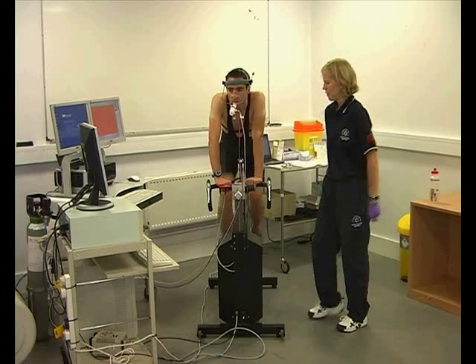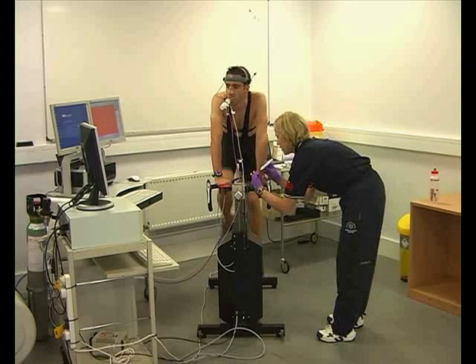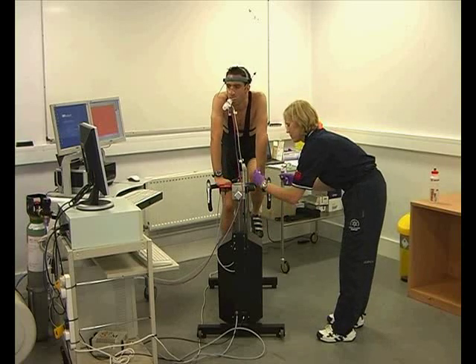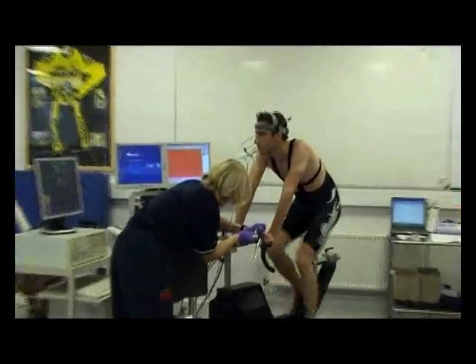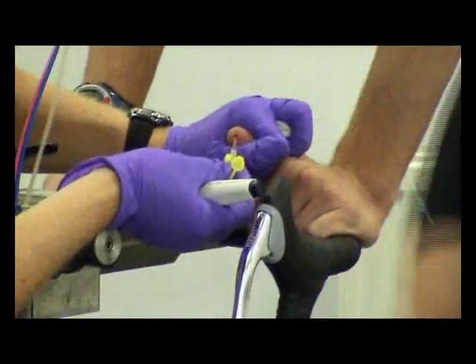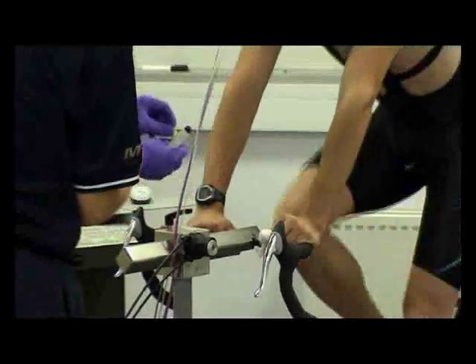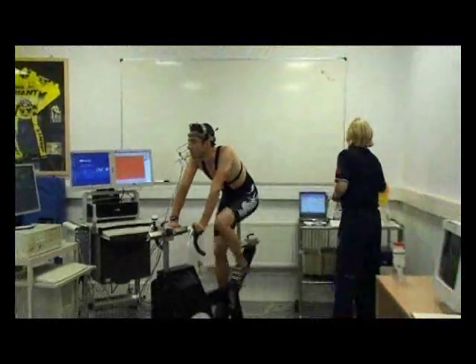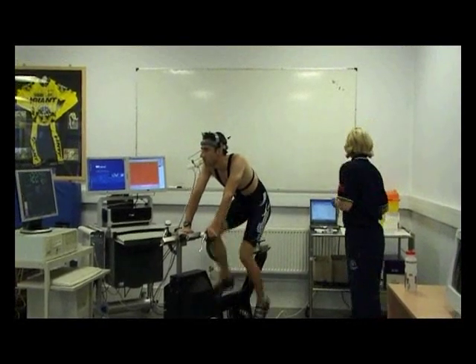Here we come to the end of the first stage and the first blood sample is going to be taken. A small puncture is made in the skin and the first bit of blood wiped away. And then we collect the blood in the tube. About 25 microliters is needed for a sample. And then we give the athlete a bit of tissue just to make sure that the wound doesn't keep bleeding. Once the sample's taken, the blood in the tube needs about a minute to mix.